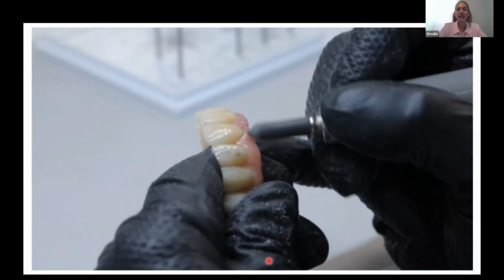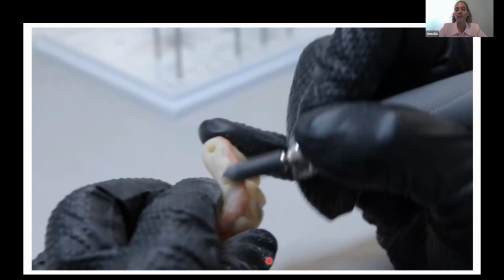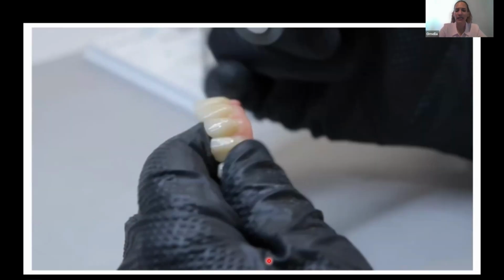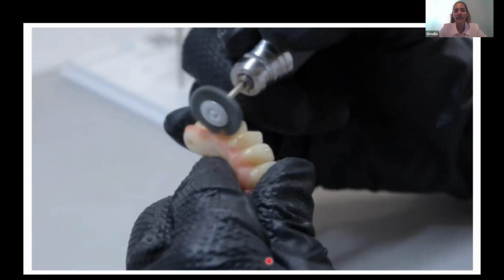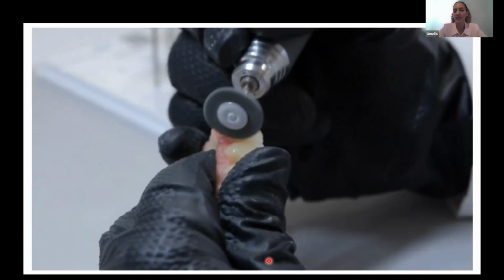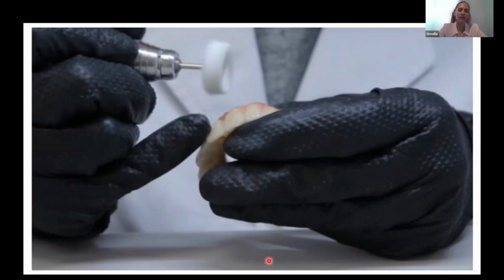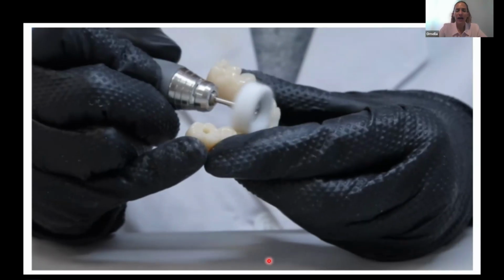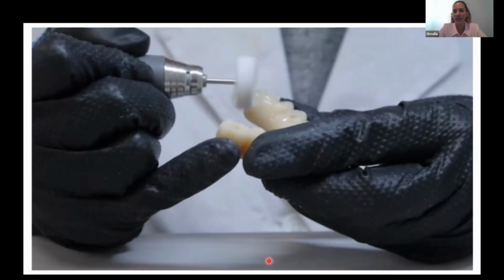I think that all materials that are hand polished are going to have a better result, okay, in the future. In case that I put the staining, okay, obviously I need to place the glaze, because the glaze is the one that is going to seal the color of the teeth and make sure they stay there, okay? But finally, we always do the hand polish, and you can see that we do the aesthetic only in the vestibular area, okay? Not in the back or in the bottom, okay?